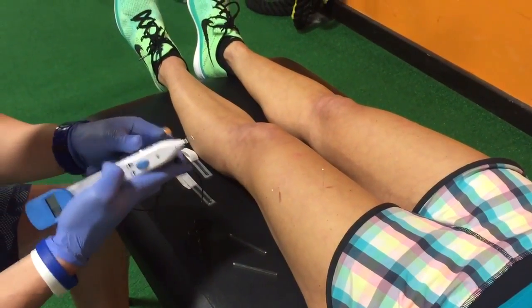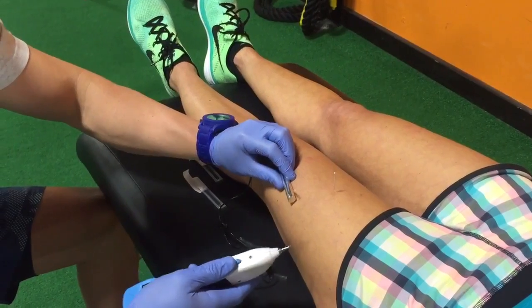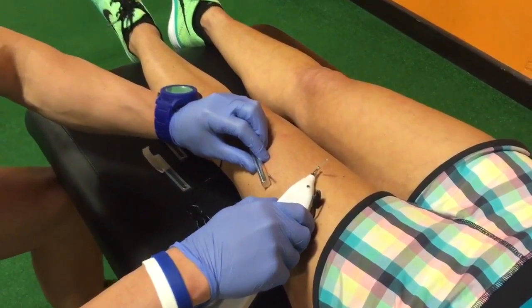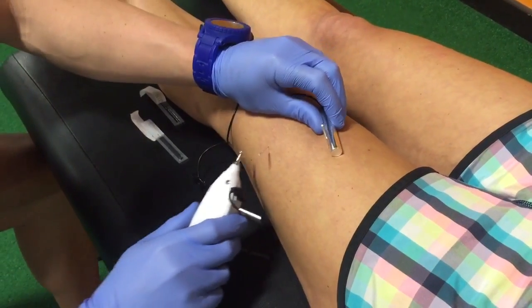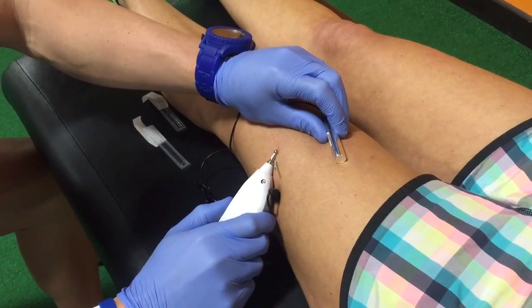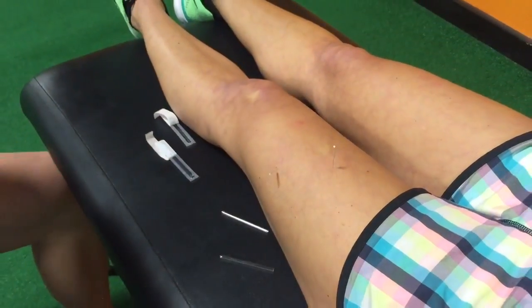Next step, take the e-stim unit and we're going to get a little bit of a muscle twitch out of it. You can see the vastus lateralis go with the twitch response, then we're going to switch these two up. You're going to see the muscles go again. Quick and easy.